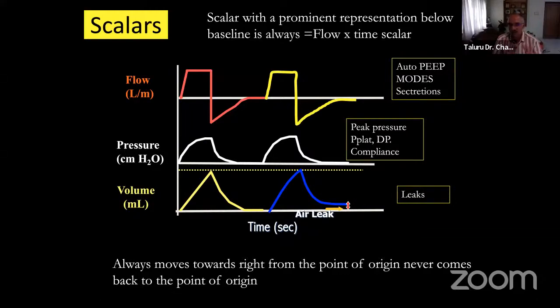So volume versus time will be ending here, you remember that. And when we talk of these scalars, you should remember, when you're talking of flow, everything will be flow. You should not add up any pressure here. This will be the peak inspiratory flow. This will be the peak expiratory flow.